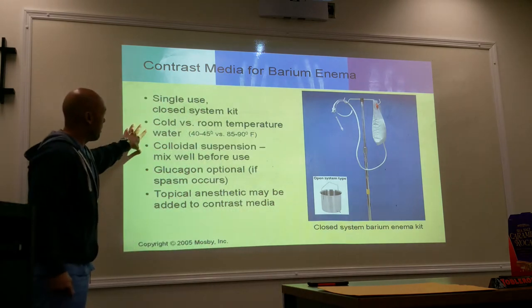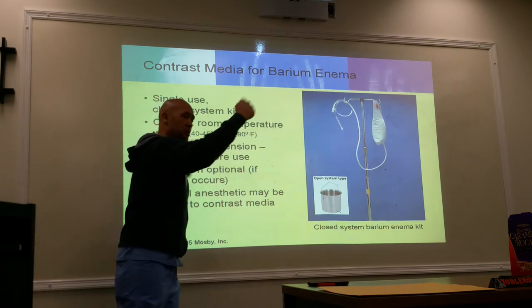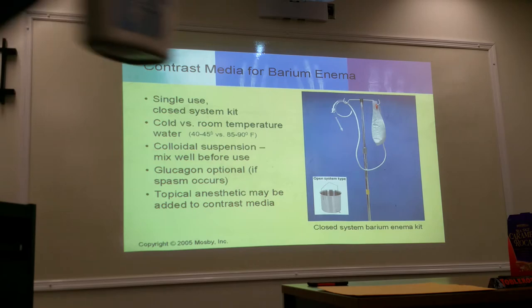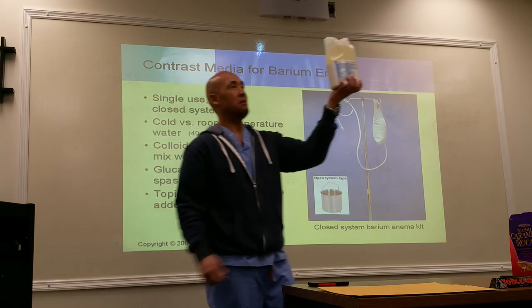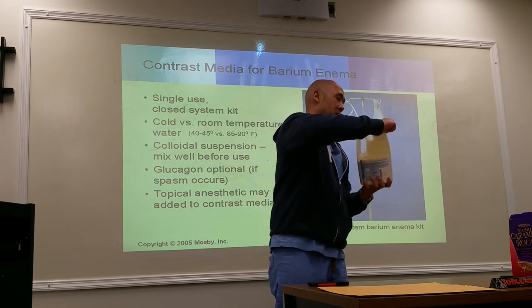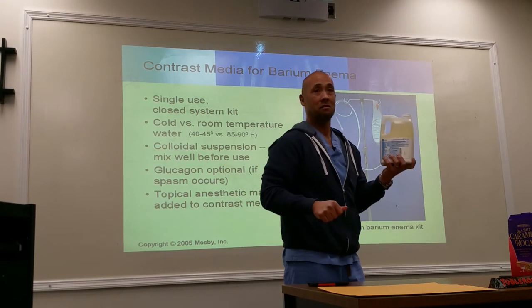Which takes us to the next one here, the water that you use. Oh, by the way, I'm sorry. It can come either in a powder form and you mix it up, or we also have it already pre-made. This is a barium. It is a colloidal suspension. So look what happened to the barium. It sat there for a while. So all the metal, because barium is a metal, right? All the metal settled to the bottom. This is pre-made, so instead of the powder and adding water, it's already pre-made and you just pour the barium into the bag.